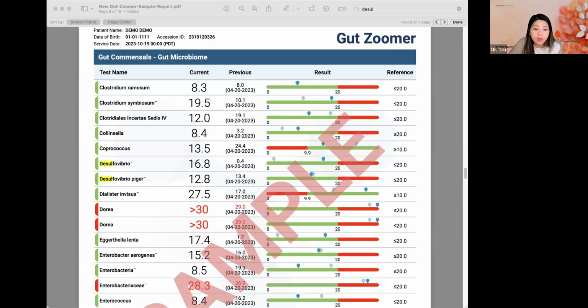And then the last group that we're going to discuss is proteobacteria. These guys represent between 2% to maybe 10% of the microbiome, and they're gram negative, and they usually produce pro-inflammatory LPS, which is the lipopolysaccharides. You don't want a lot of these guys around, okay? They have a lot of species that are known to cause diseases, and they thrive in inflammatory conditions.